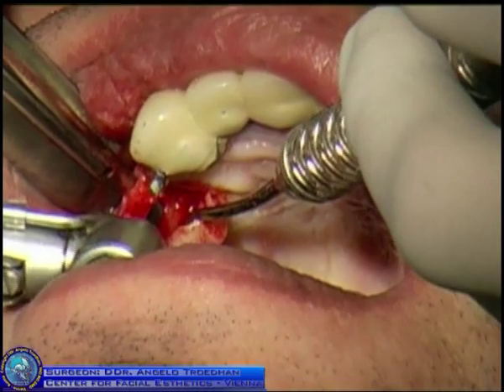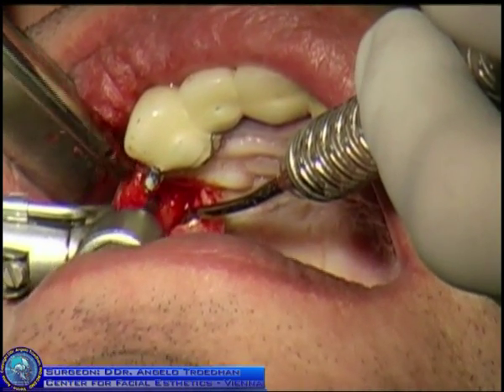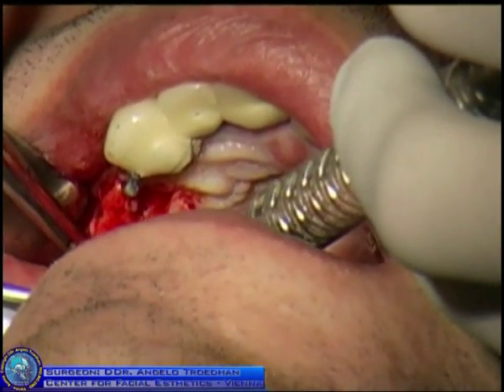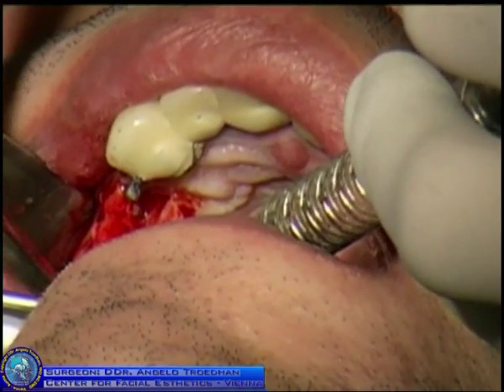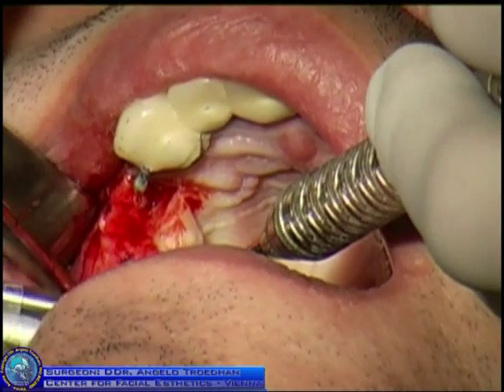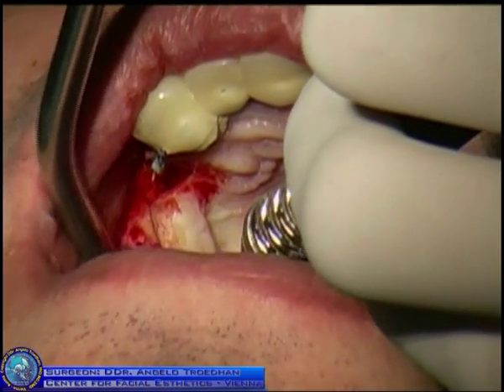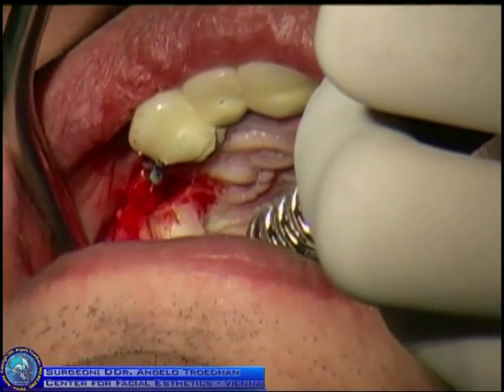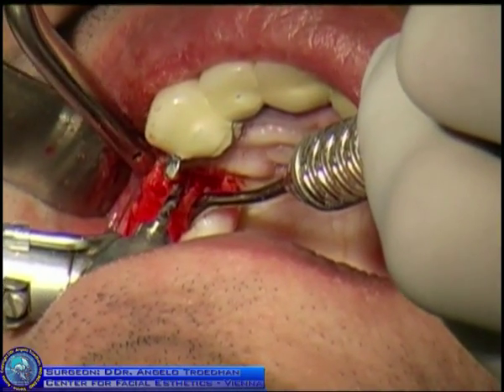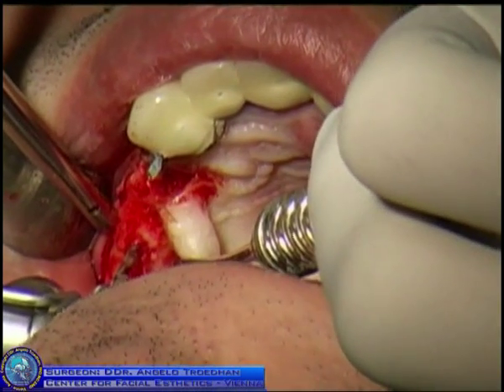So this is what I call the marker drill. It's very slow turning. This is not very crucial because this is going to be the place where we are doing the intralift. As I was explaining in the workshop, to speed up the entire procedure, we do the primary approach to the sinus with the conventional drills of the implant system.